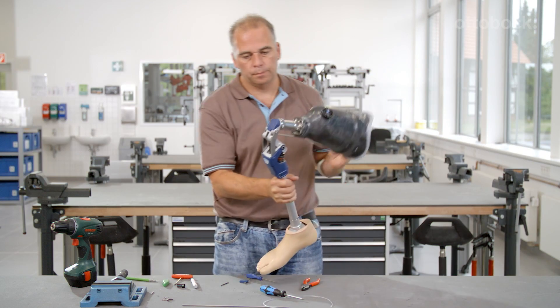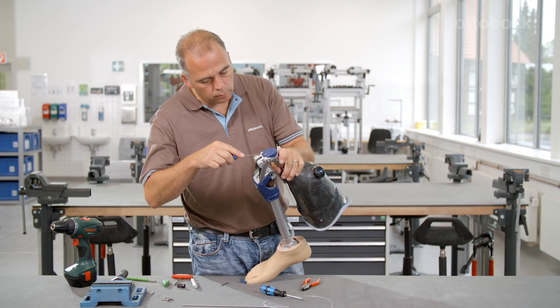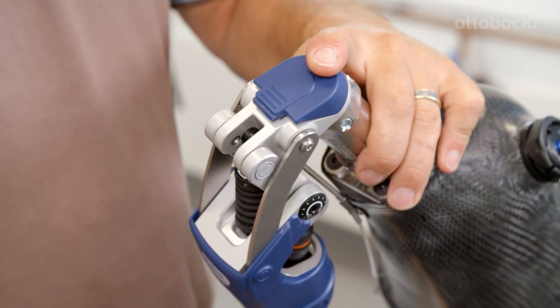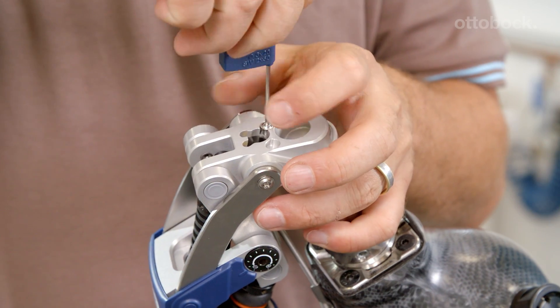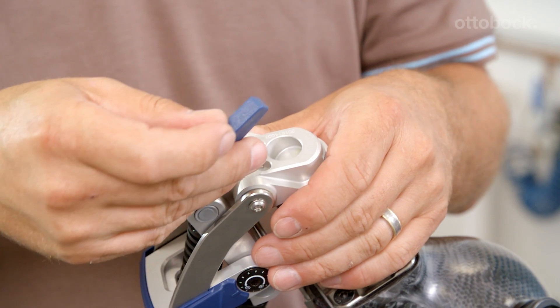With Pheon, there is the option to activate the manual lock by removing the screw on the bottom side of the knee joint head. The lock then reliably locks the knee in full extension and can only be unlocked when the lock release cable is pulled.